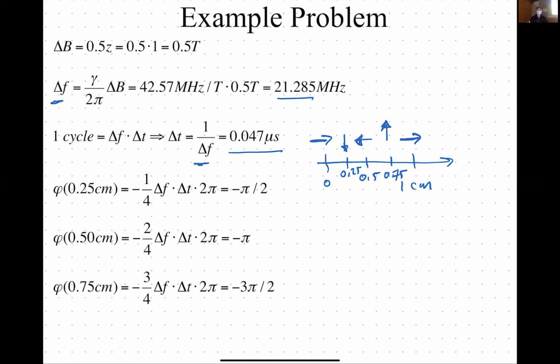in the problems, where you're asked to visualize what the phasors are doing and how they're oriented as a function of space. So typically, if you have a uniform gradient on for a certain amount of time, you're going to just see the phasors wrap around, okay, and then they'll repeat at some cycle. When you look at these diagrams, you'll say, okay, what's the period at which this pattern is repeating, and which way is it going? Is it going clockwise or counterclockwise? And that will give you what you need to know. All right.